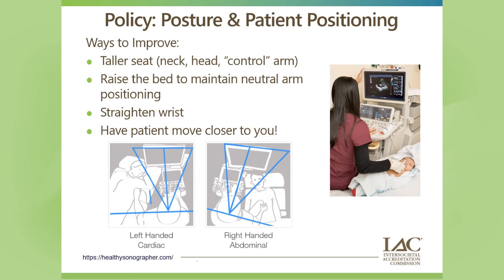And then I've included a website here that goes through some different ways to scan and set your system up, as you can see with these diagrams down here, for a couple different modalities.